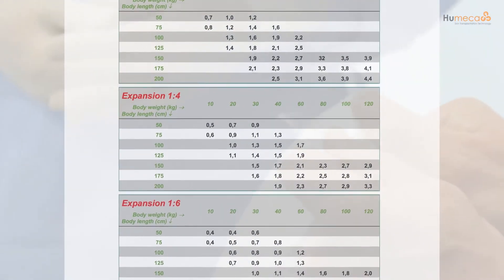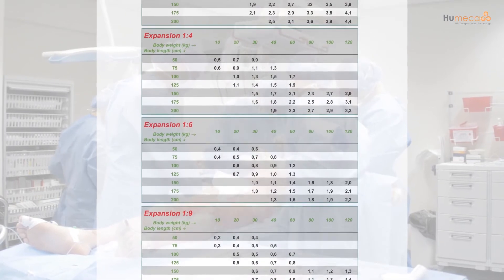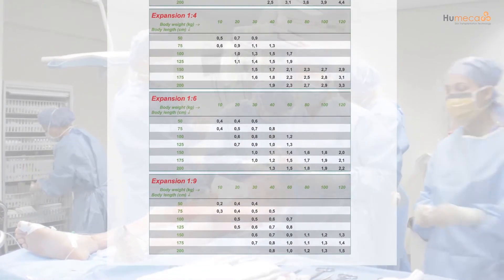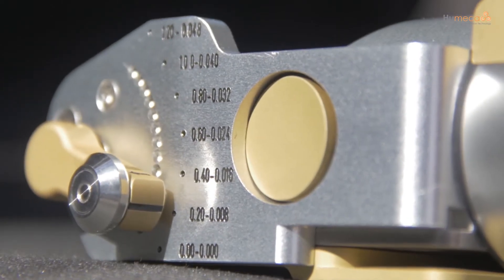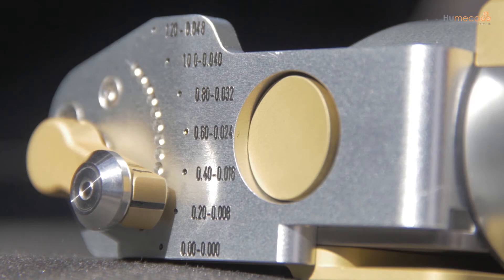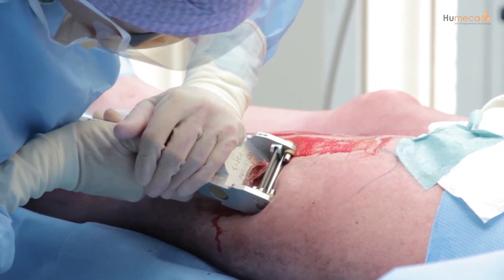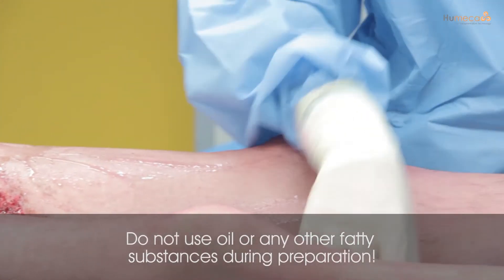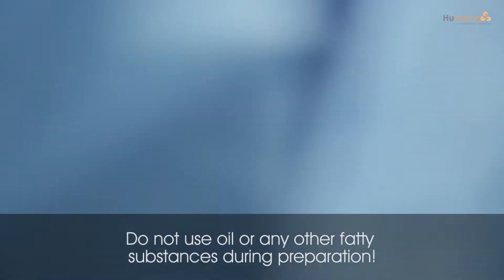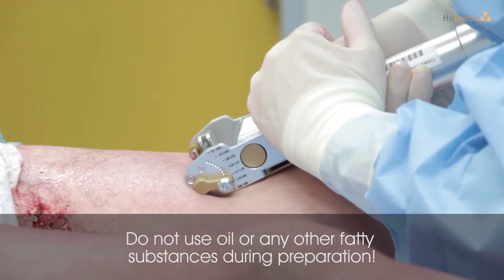Estimate the amount of skin you need to harvest. Please use the sheet indicating the number of Meek gauzes required per percentage TBSA as a guide. A split thickness skin graft between 0.2 and 0.3 millimeters is often used for harvesting. It is recommended that the D42 dermatome is used, as its dimensions are specifically designed for the Meek technique. It is very important not to use oil or any other fatty substances during preparation of the donor site or during graft harvesting, because oil prevents the glue from sticking the graft to the gauze.